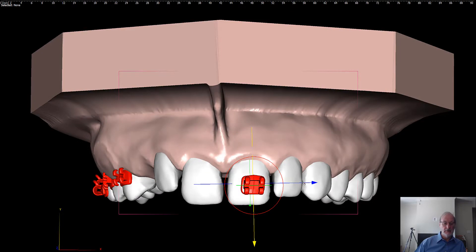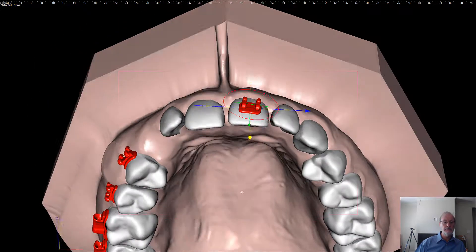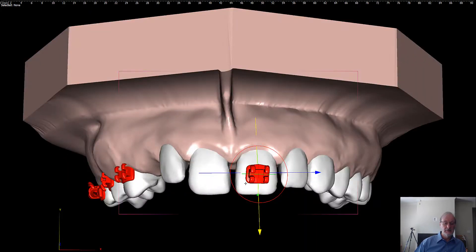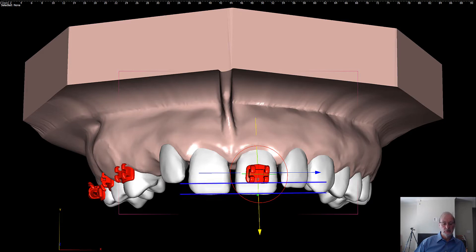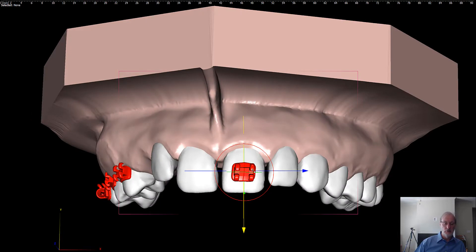The first very important aspect is to position the bracket in the center. You need to position the incisal aspect of the bracket parallel to the incisal edges. So the first step is to center the bracket mesiodistally, and the second step is to position the bracket with the incisal edge parallel to the incisal edge, which, according to Andrews, has to be positioned in a particular way according to the prescription of brackets you use.